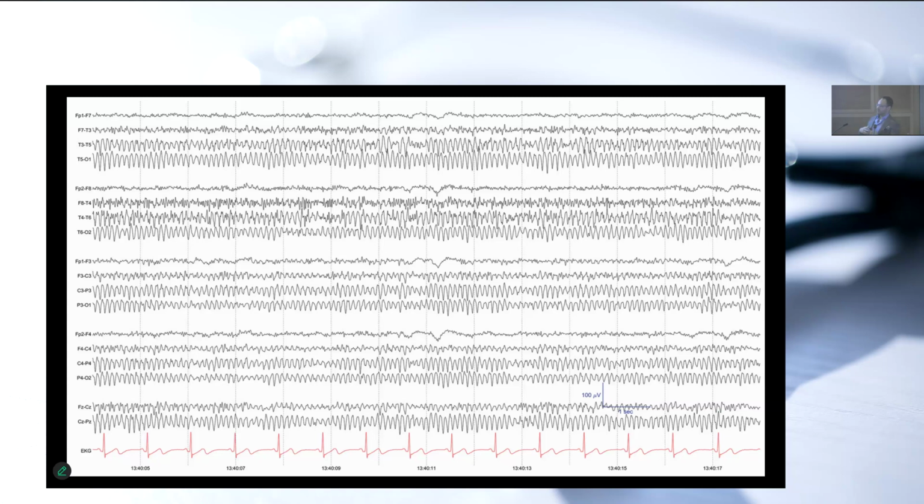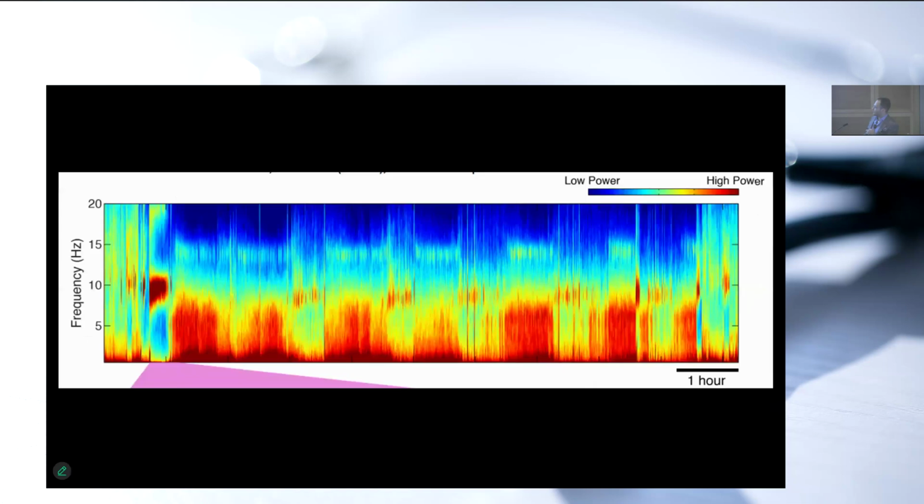But if I wanted to give you an entire night's EEG to look at the sleep architecture, that would be a very inconvenient way to do it. You'd be marking things and measuring intervals would be awful. So if we could look at this instead over a larger period of time and in the frequency domain, it would be much more useful. So for example, if I could give you an entire night's sleep, 6-8 hours of sleep, where I could say, okay, here is the EEG composition at this time and this time and this time, that's a much more convenient thing. So this is called a density spectral array or a spectrogram. And it shows us frequency on this axis and time on this axis. And each vertical stripe here is a piece of EEG that has been transformed in this way. And I'll explain how that works.